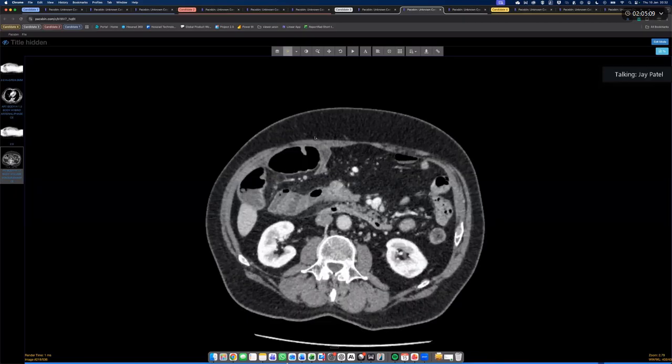These mass-forming apple core, big stricture, fleshy things. The other type, more unusual, is the sclerotic type, where it just narrows down and causes strictures without any real mass effect. Typically, they occur near the splenic flexure. It's a subtype, and typically they're also pretty aggressive.